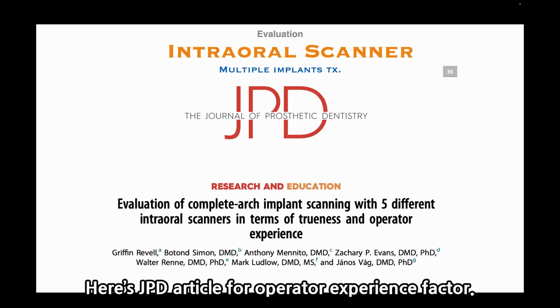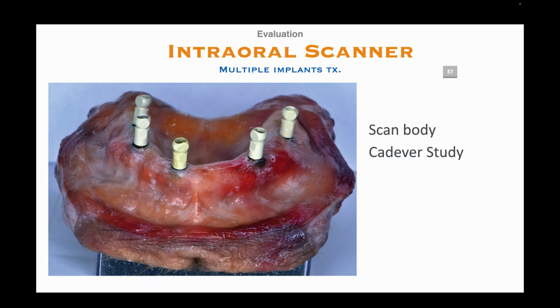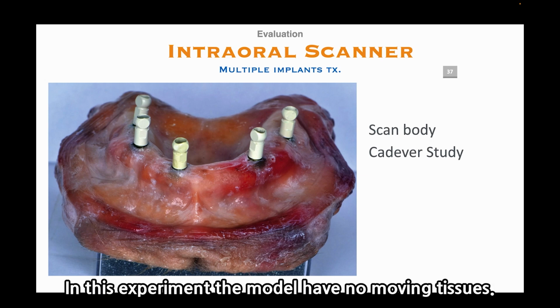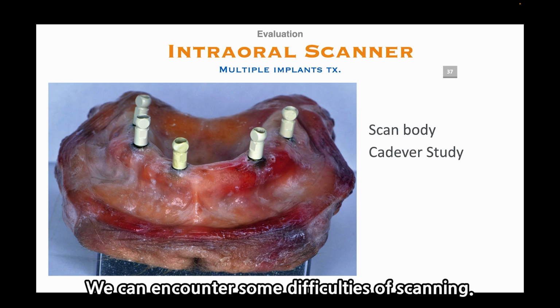Here's a JPD article on the operator experience factor. They used a cadaver to simulate the oral environment. In this experiment, the model had no moving tissues. We can encounter some difficulties of scanning.